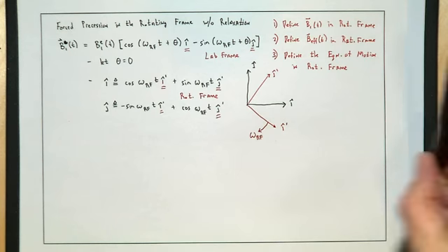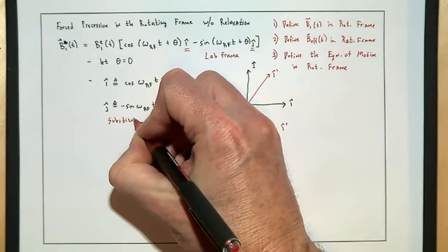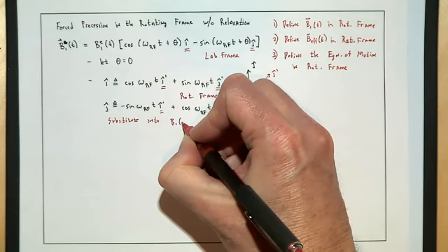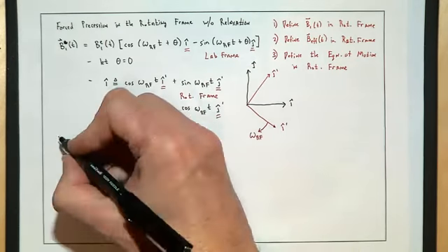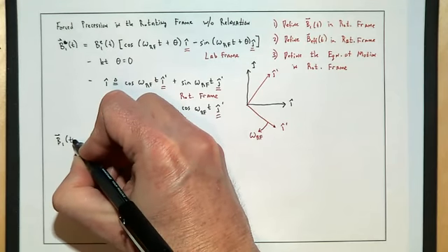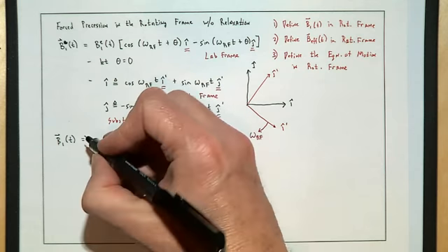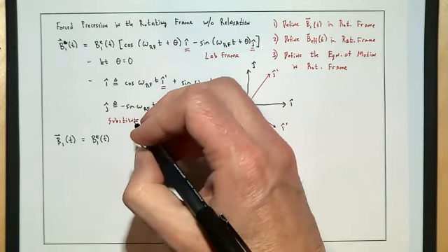Okay. Not too exciting. It's always nice when you work with sines and cosines, right? Because things always cancel. So if we put those terms inside, we end up with our leading B1 envelope function, which can be a function of time.